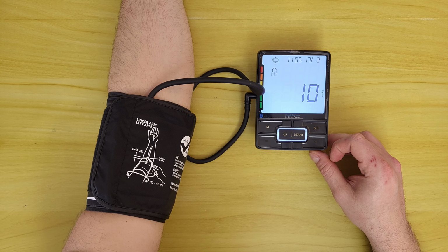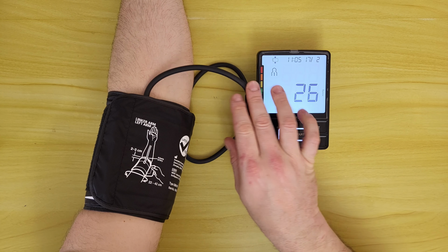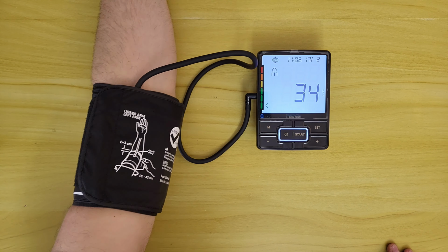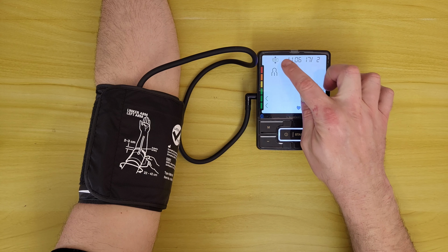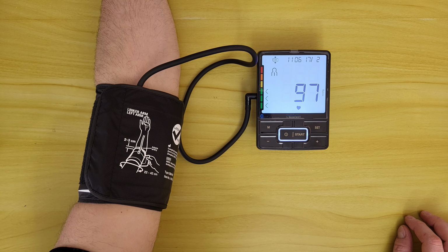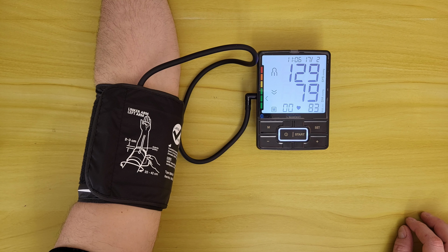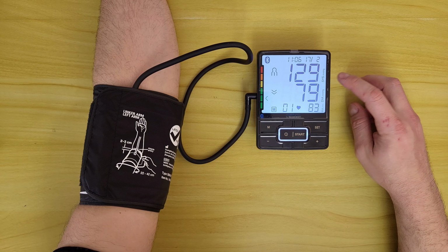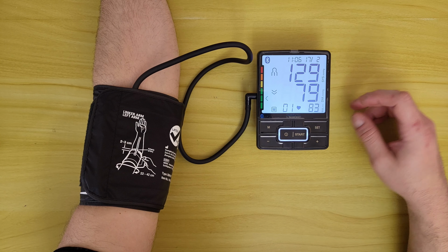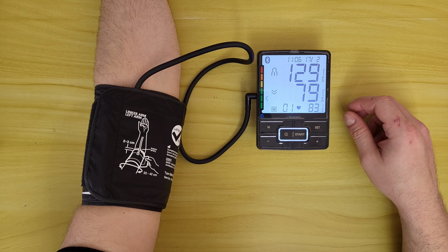You need to be calm, breathe regularly. Cough, it is okay, it says. Okay, great. And we can see we've got some values. We've got the systolic, diastolic, the pulse. And this is the first measurement. We can see we've got the heart rate icon, first person.